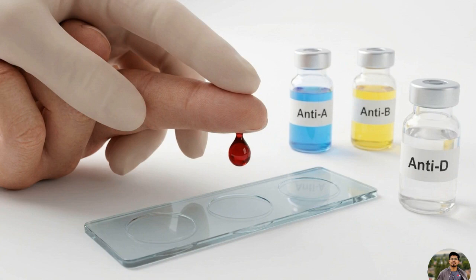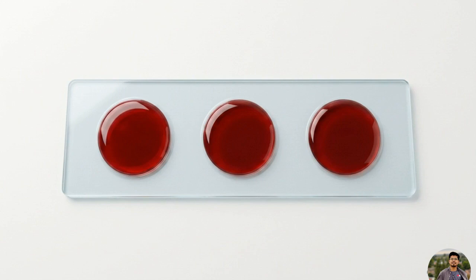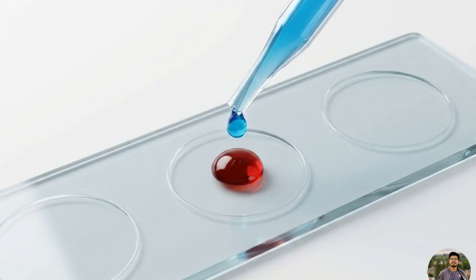Apply gentle pressure to the finger. Allow one distinct drop of blood to fall directly into each of the 3 labeled sections on your glass slide. Keep them spaced out evenly. Placing these sterile, perfectly isolated drops of blood creates an uncontaminated baseline, giving us 3 separate identical canvases for our chemical tests. Now we introduce the antibodies.